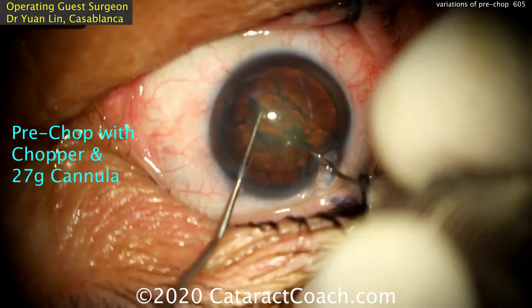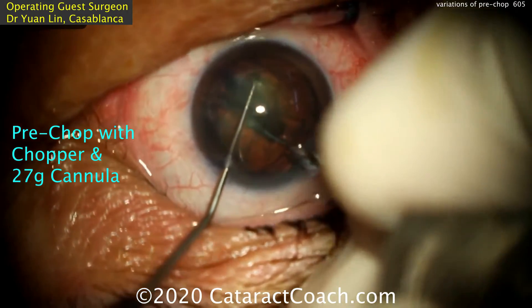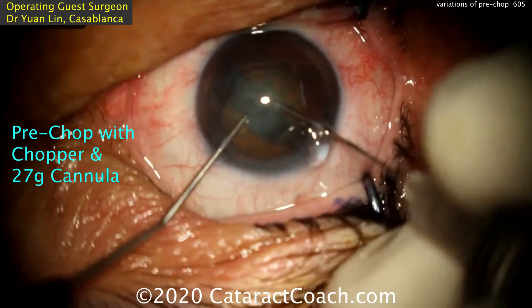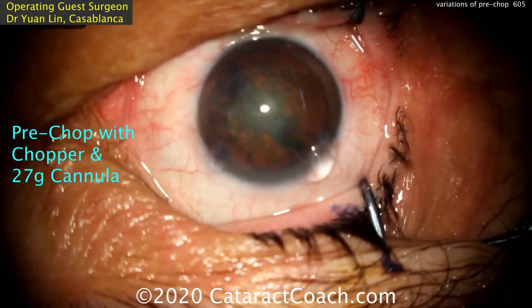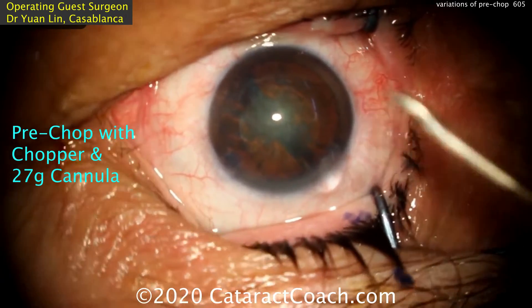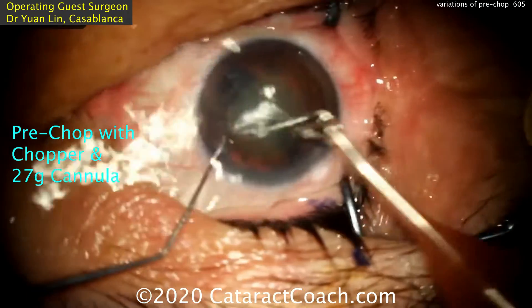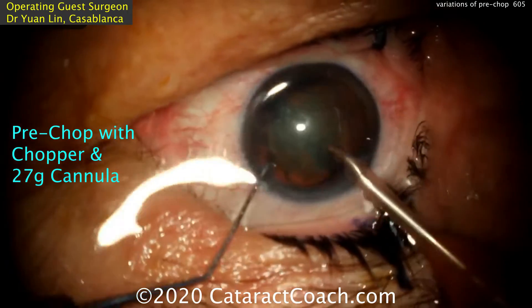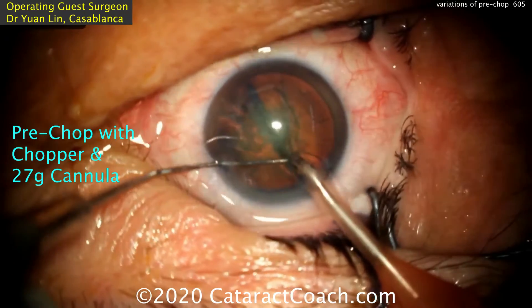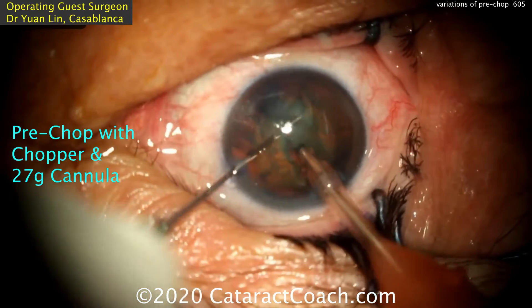Now here's pre-chopping with a chopper and a 27-gauge cannula, something you've already seen on Cataract Coach. For many of my residents, I'll go ahead and do this type of pre-chopping before they put the phacoprobe in the eye. For a junior resident, it's like cutting up food ahead of time so they can just use the fork and eat the pieces — similar concept. Split the nucleus with the chopper and the 27-gauge cannula.